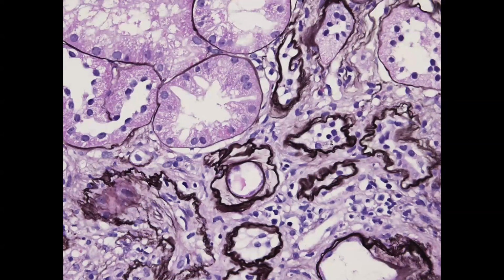This is the classic, not otherwise specified form of renal tubular atrophy. I think now you will look in every picture for vacuolization. It is clear again here. This is a proximal convoluted tubule, by the way.